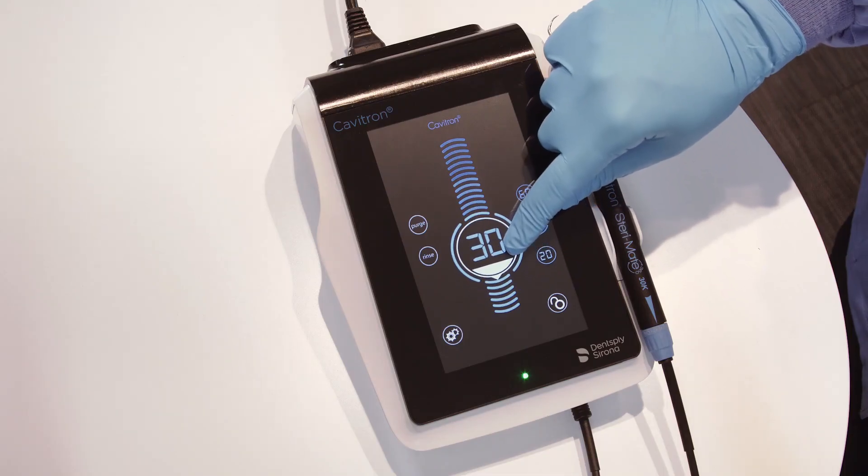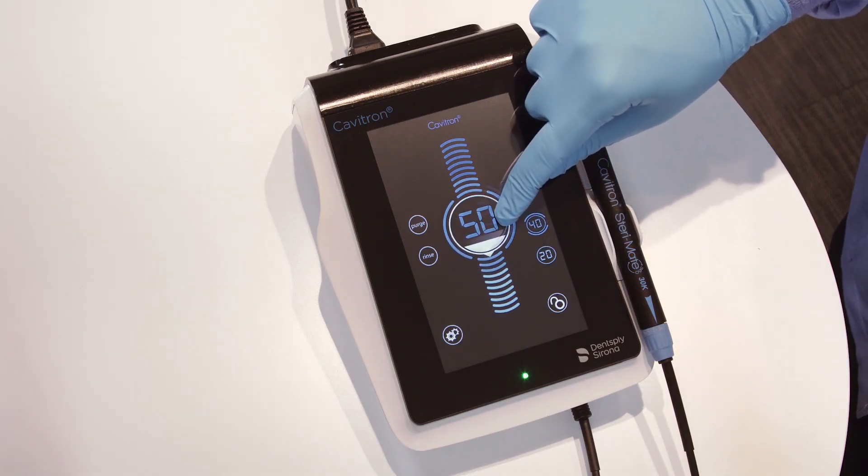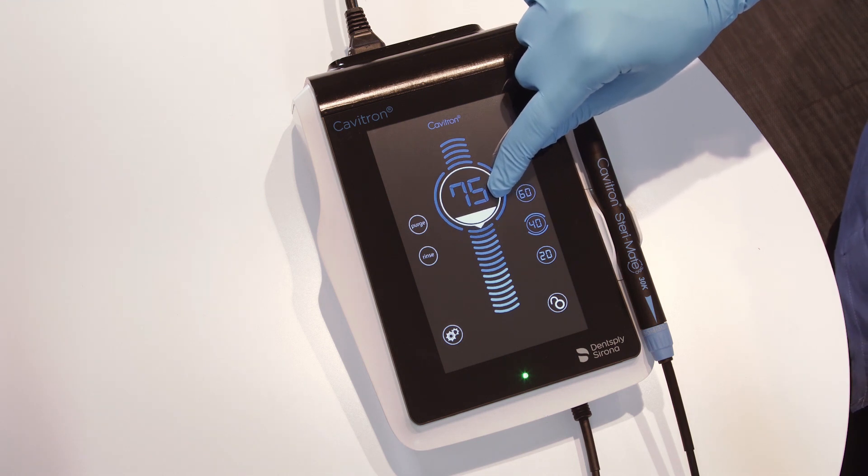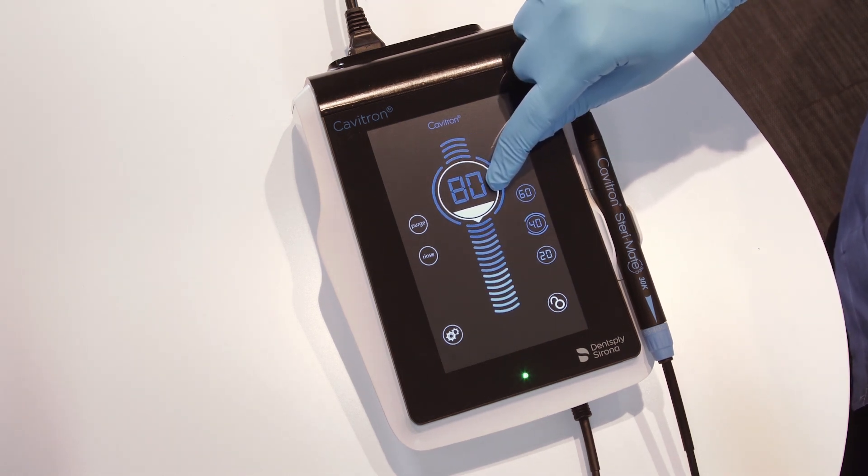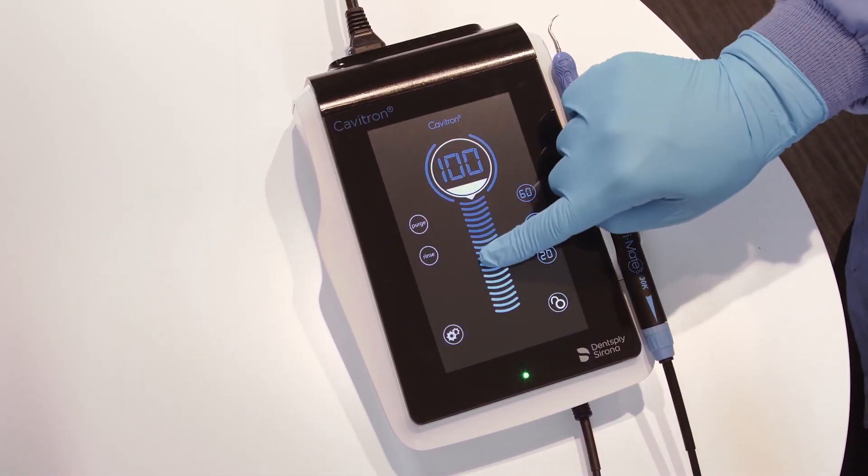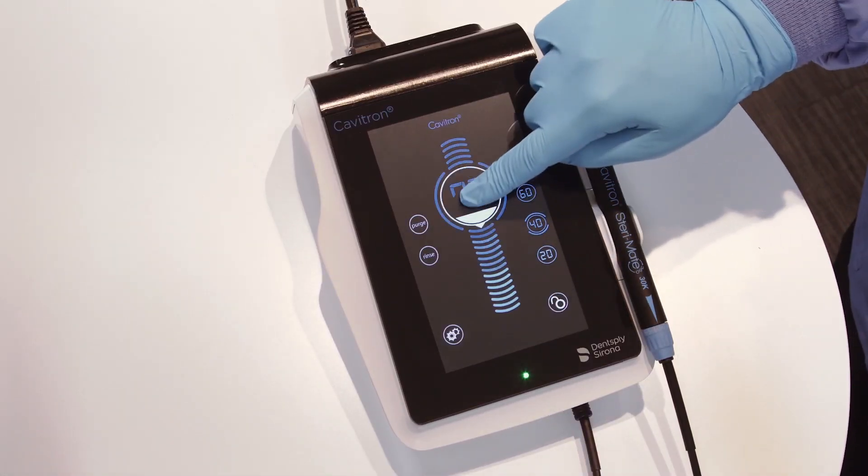To control the ultrasonic power level, simply slide to select your desired power level. Sliding up increases the power, while sliding down decreases the power. A power level may also be selected by tapping the desired position on the power scale.